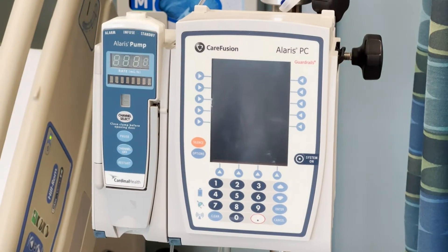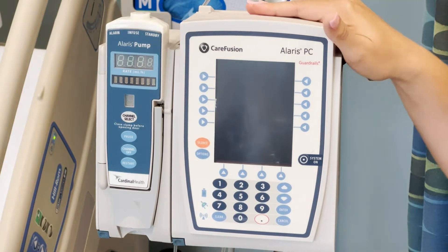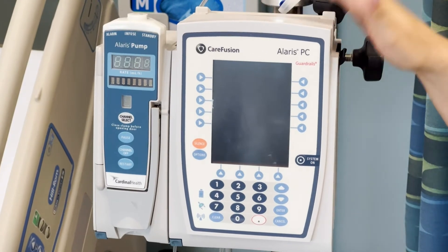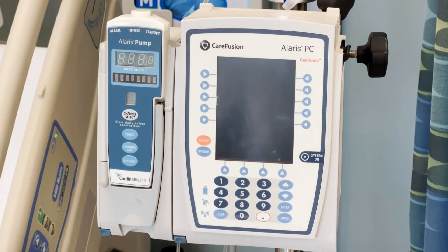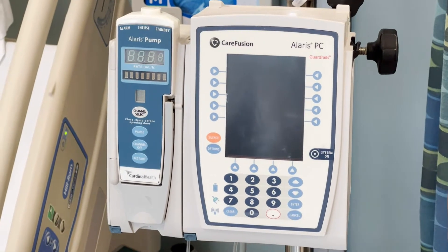This is a tutorial on how to use the Alaris IV pump. All facilities will have different variations of these pumps, but they pretty much all work the same. I'm going to walk you through how to turn this on, how to run a primary infusion, how to run an IV piggyback, and what to do if you need more channels.